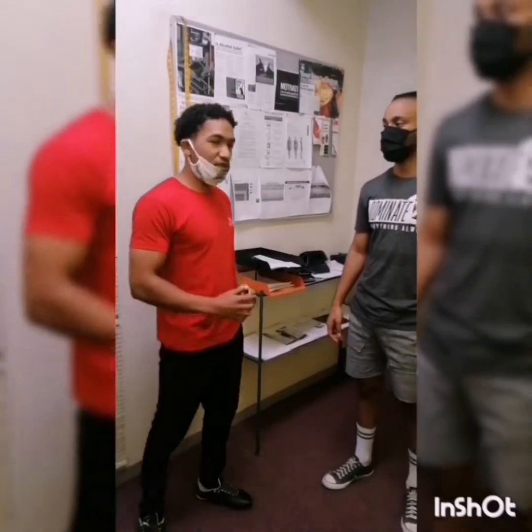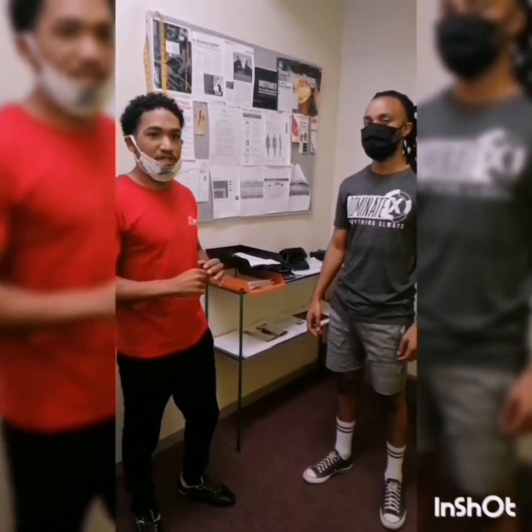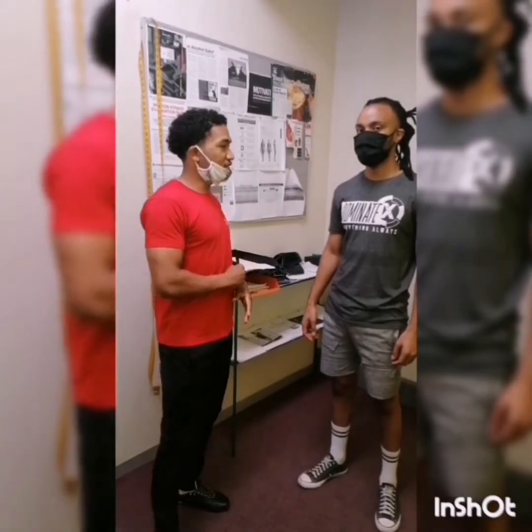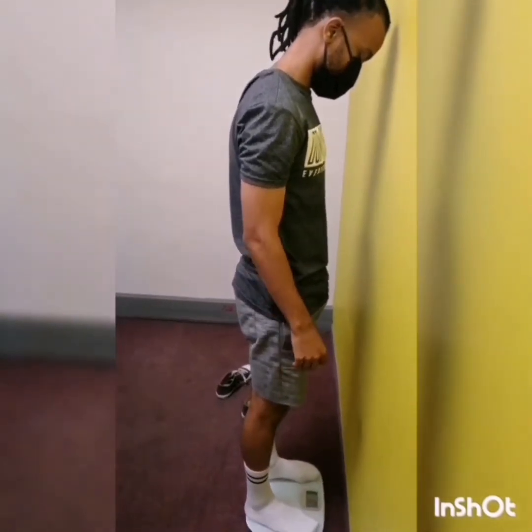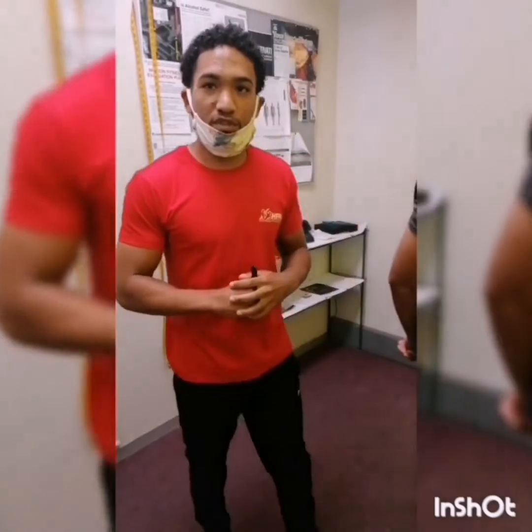So next I'm going to take client's BMI. BMI stands for body mass index. To measure client's BMI, I'm going to take his weight and his height. So we're going to start off with his weight. Now I'm going to ask client to step on the scale. Can you please remove your shoes? So client's weight is 70.45.